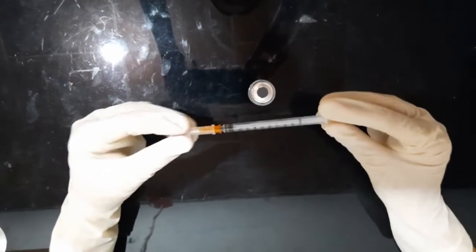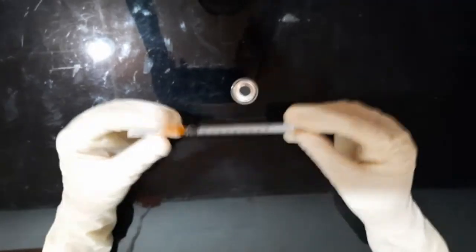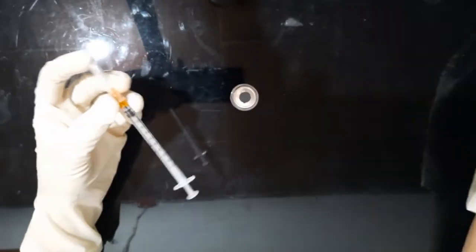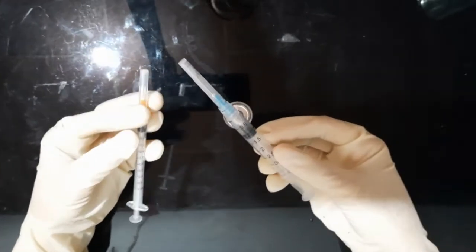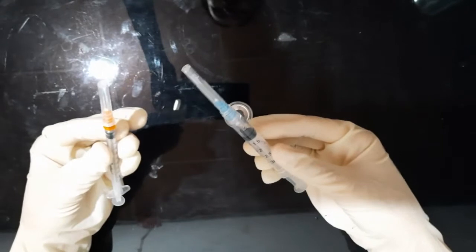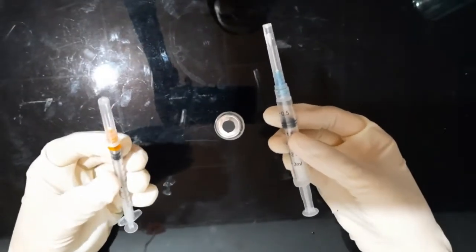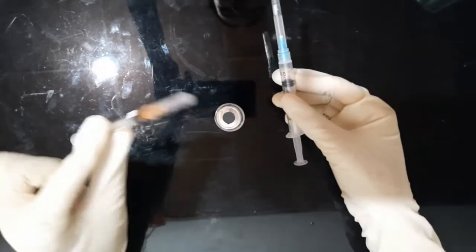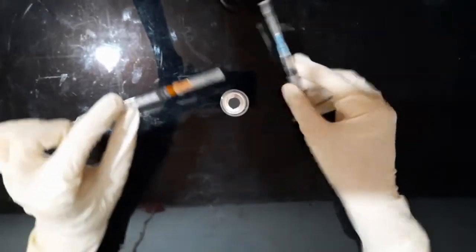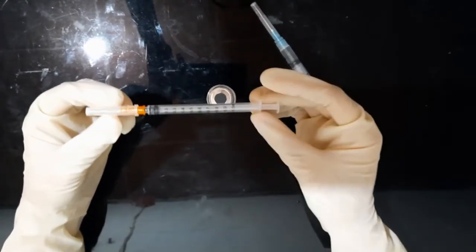This is a very little syringe. This whole thing is 1 ml. So for comparison purposes, this is a 3 ml syringe. So this whole thing is the equivalent of just this little bit in this syringe. So this does not hold a lot of fluid. This is not made to hold a lot of fluid. So this is the 1 ml syringe.